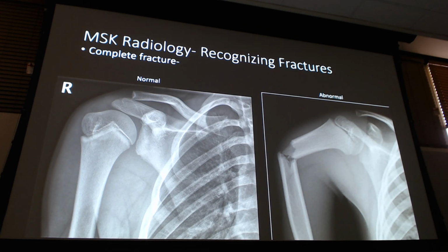For a little more obvious for you guys. Okay? This is normal because it's pediatric. That's not a fracture. How the heck are you guys supposed to know that? So I'm not going to test you on that kind of thing. This is a bad day. This is going to need surgery probably. It's a kid. They might just straighten it and splint and put it in a cast. I don't know. That's a question for ortho next semester. But yeah. Okay. Moving on.